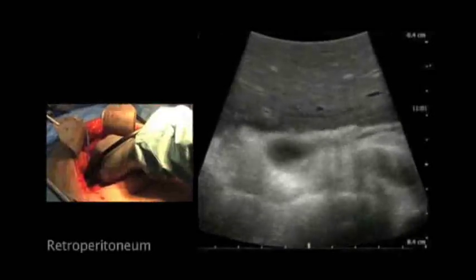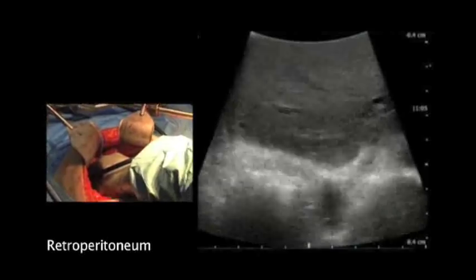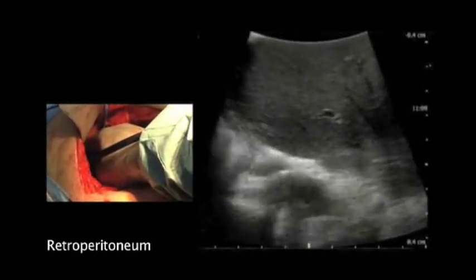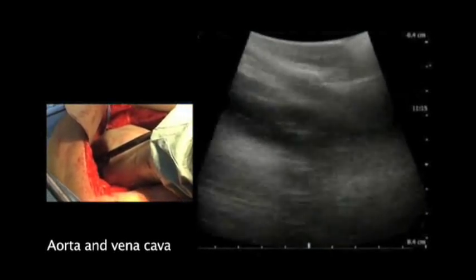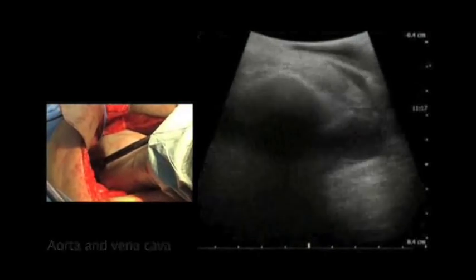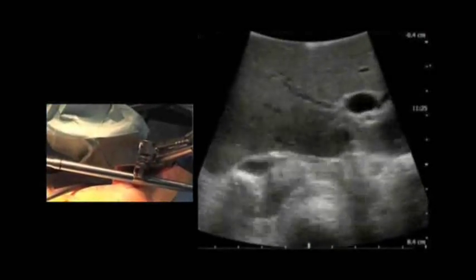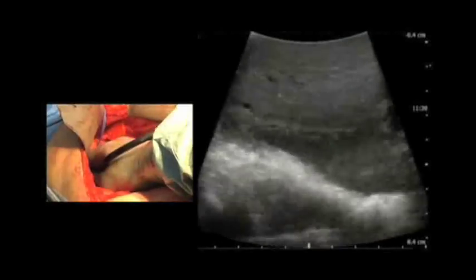I end up by looking in the retroperitoneum, and we can see all the structures here behind the liver. We have segment number one isolated in the middle of the image. The aorta is pulsating to the right, the vena cava standing still to the left, and the columna in the lower middle part of the image. Then we have the branching of the portal system here. That is one of the methods you can use to scan the liver segment by segment.